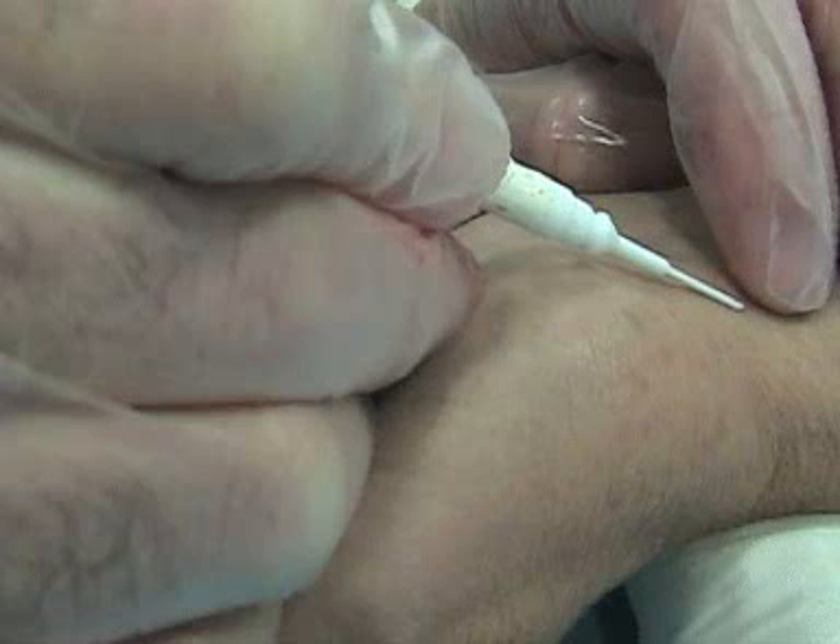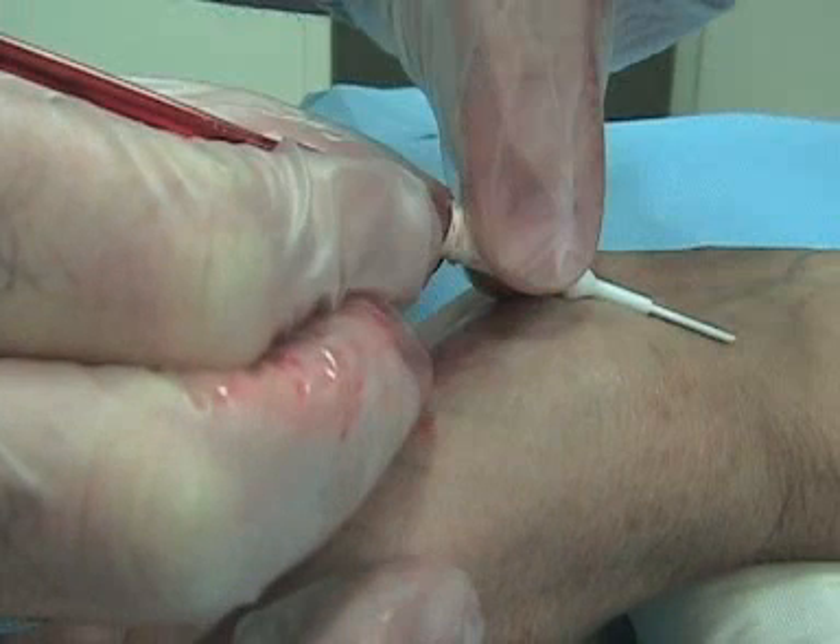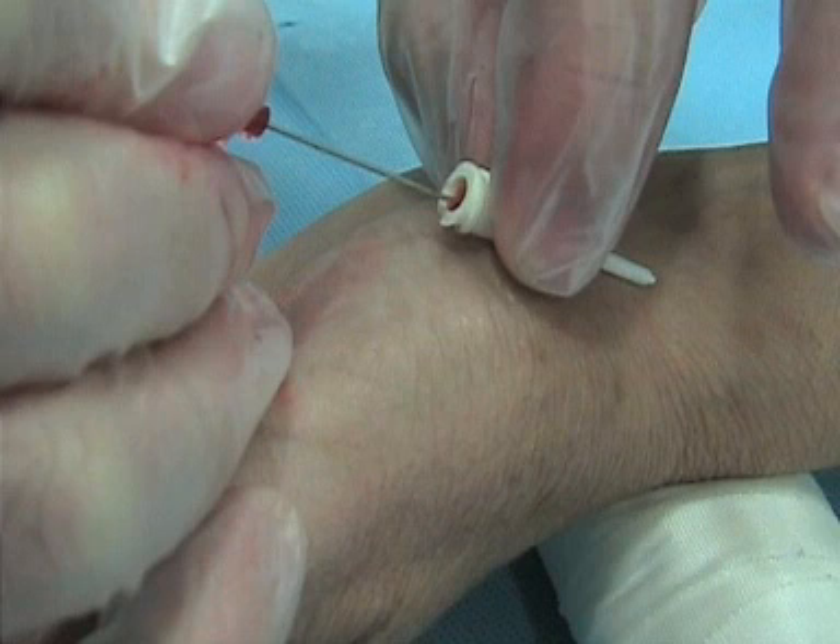In you go, and you can see I'm now in the vessel, maintaining that nice shallow angle. A little bit of blood is coming back so you know you're in — that pulsatile blood should keep going. Now you're getting ready to slide the catheter on in, and now you're all the way to the hub.